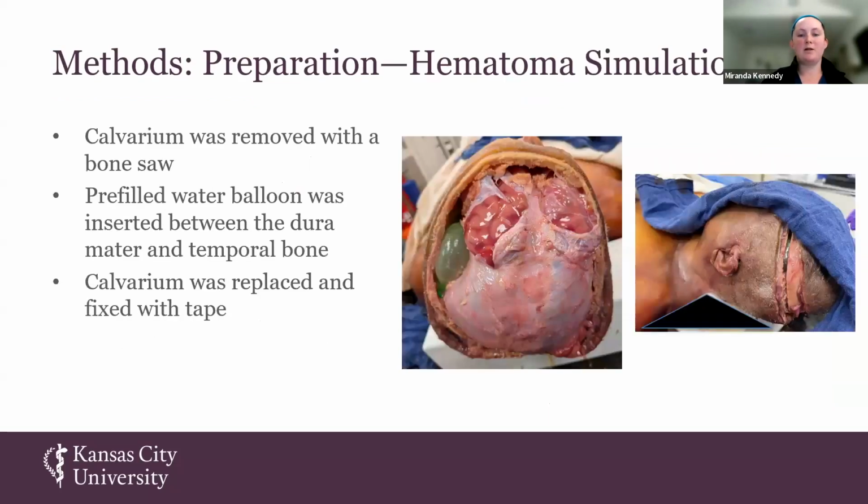Next, we prepared the hematoma simulation. So I removed the calvarium, and the simulated hematoma, or water balloon, was inserted between the dura mater and temporal bone. And then the calvarium was replaced and fixed with tape.